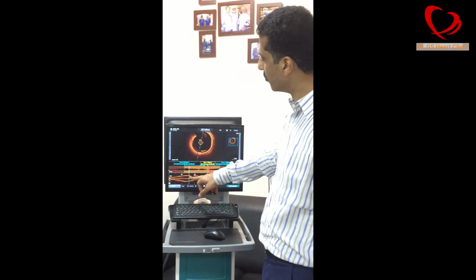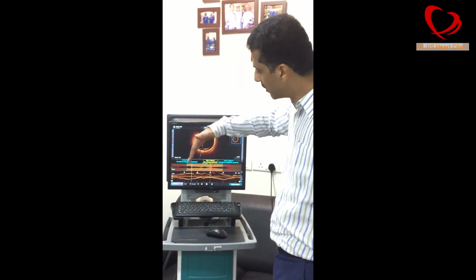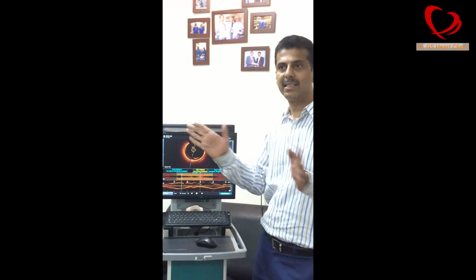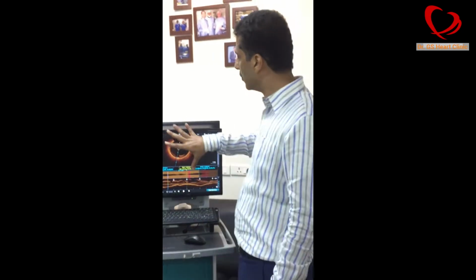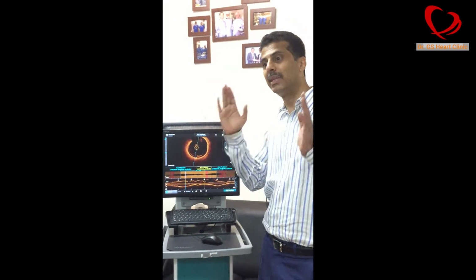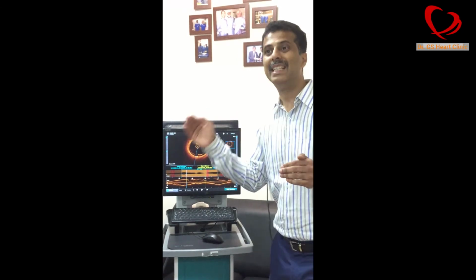We want to identify a stent. We don't want to stent only that small area. We want to start from the normal segment and land up in the normal segment, so that the entire disease area is nicely stented. Okay. So when we do OCT, we use that. Another advantage of OCT. So we can plan the right size of the stent, land in a good area, and post stenting we can assess whether the stent is properly placed, whether there's any damage we caused anywhere at the edges.